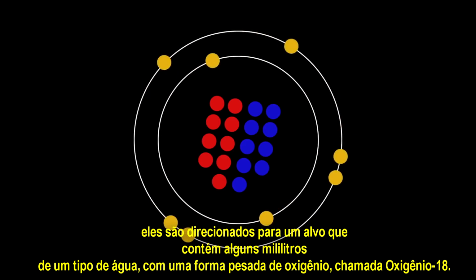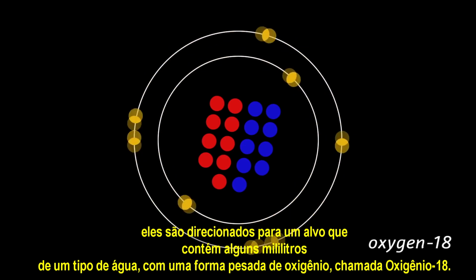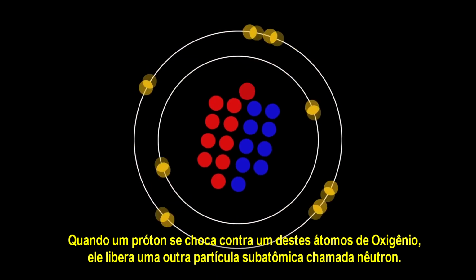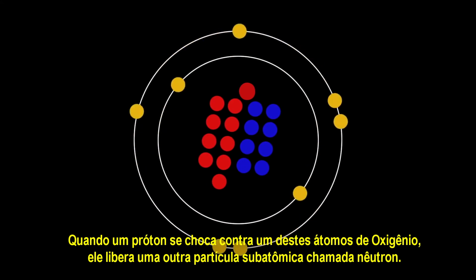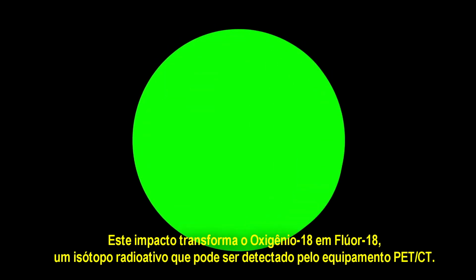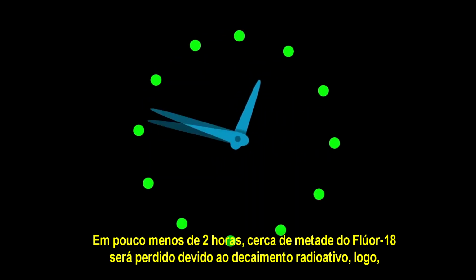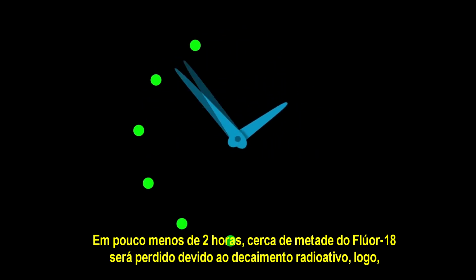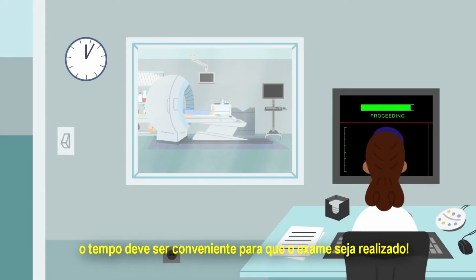That contains a few milliliters of a type of water with a heavy form of oxygen called oxygen-18. When a proton slams into one of these heavier oxygen atoms, it kicks out another subatomic particle called a neutron. This impact turns oxygen-18 into fluorine-18, a radioactive isotope that can be detected on a PET scan. In a little under 2 hours, about half the fluorine will be gone due to radioactive decay, so the clock is ticking to get the scan done.